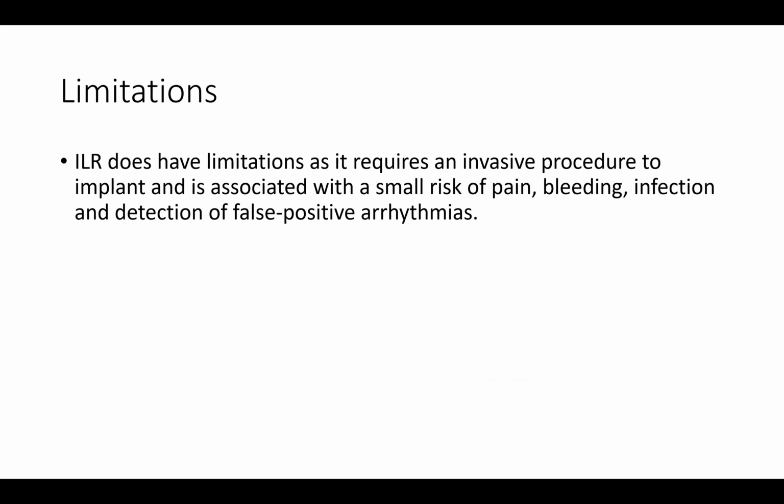Then I want to get clarity from Dr. Chris. One of the things that we found out here is that if there are recordings, assuming you have a recording from 5 days ago, 4 days ago, 3 days ago, 2 days ago, and today, you notice that some of the recordings in the past, which you have not seen, are no longer there when they come. That is one thing that we see among them here.